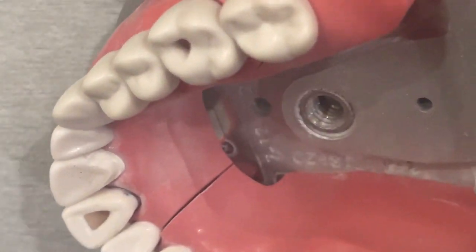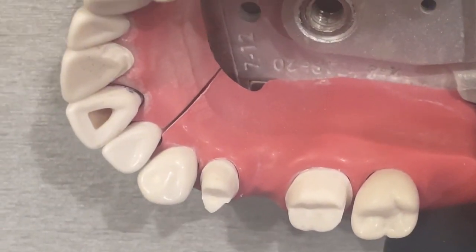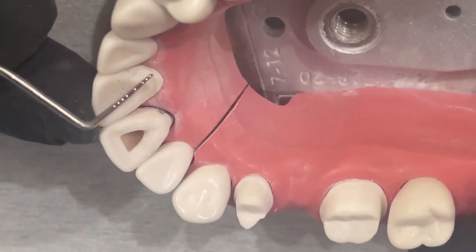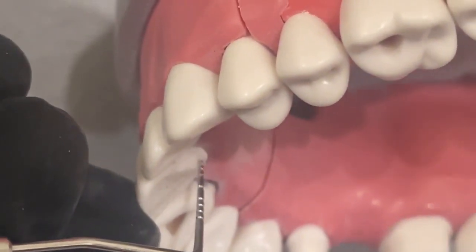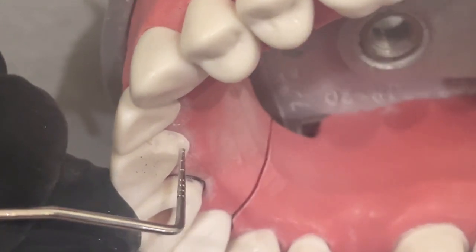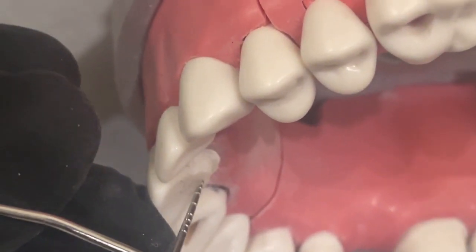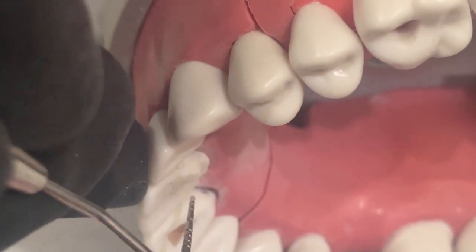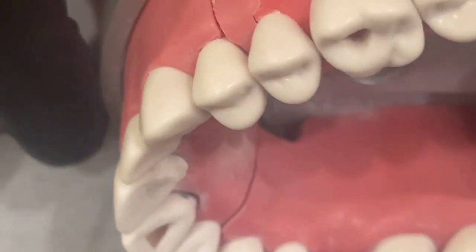Let me show you what I've done. I've almost force-created this wall. I'm basically making it up because that's what they want — it didn't really follow the anatomy of the tooth per se, but I forced my bur right there to create it. Now I've got to make the reduction of the rest of the cingulum. This is the tricky part — you don't want to lose this angle, so as you're using your bur, just stay in the deepest part of it.